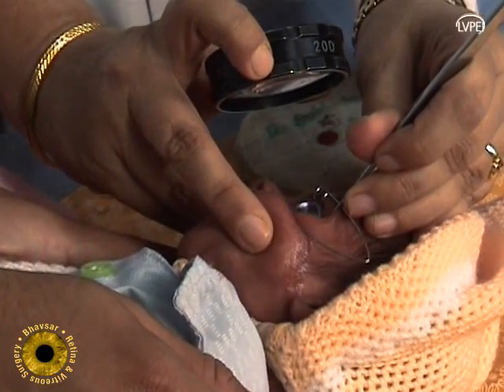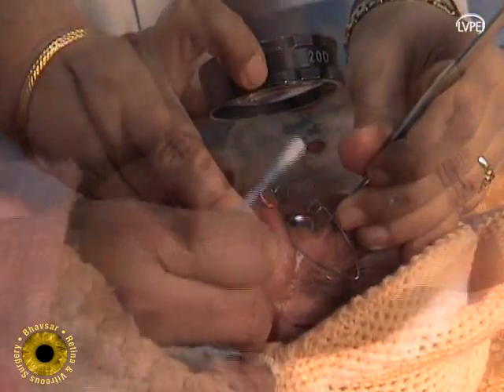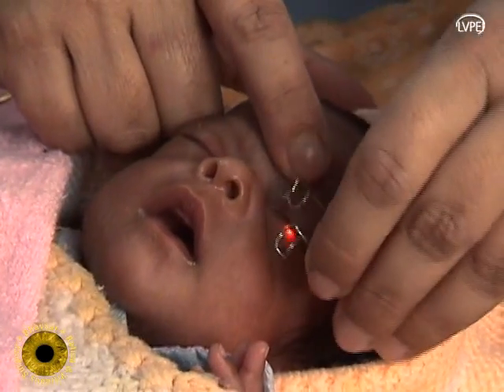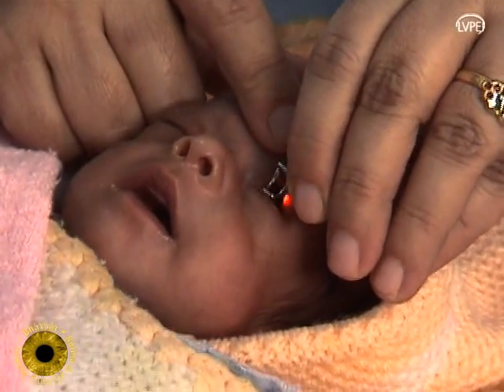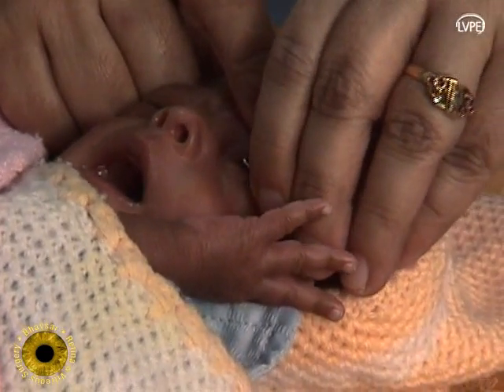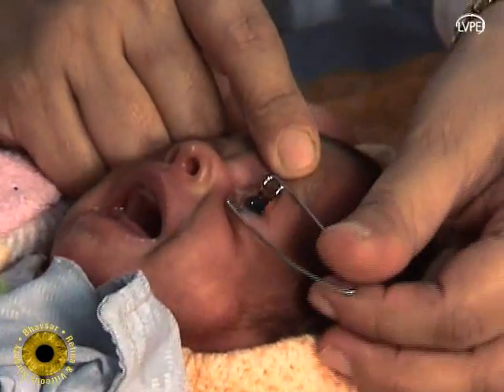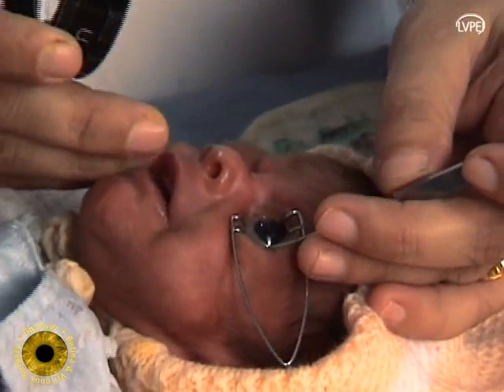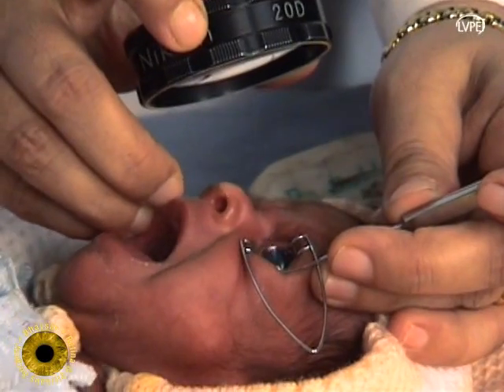The eyelids are kept apart by an appropriate pediatric speculum. The globe is both stabilized and indented using a wire vectis as a depressor.